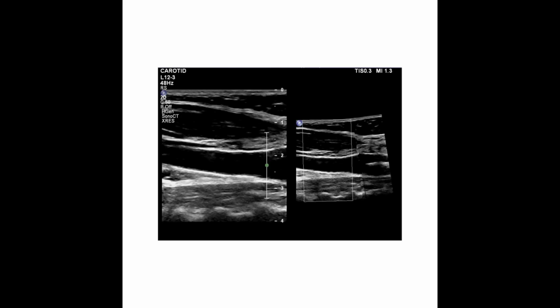And so here's another example of panoramic imaging where we can see how the frame matches up with the panoramic. So we have, again, our frame matches up exactly with the linear sequential transducer face. So however wide that transducer is, all the anatomy that you can see underneath it, that's then going to match up with this frame here that is outlined by the white box. And as the sonographer moves the transducer up the neck, it's going to acquire new frames to align side by side. So by using the panoramic feature, we can see all of the carotid artery from the proximal to the bifurcation where it splits into the ICA and ECA.